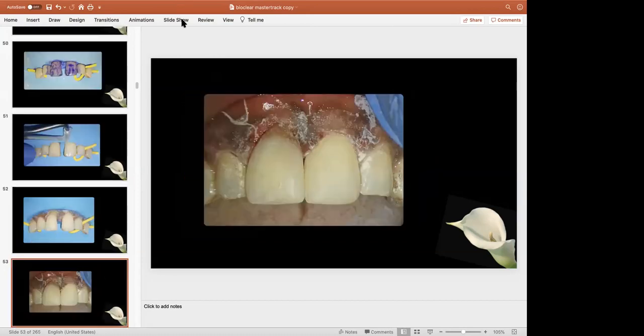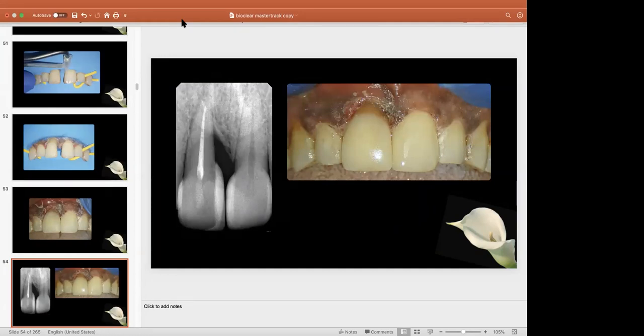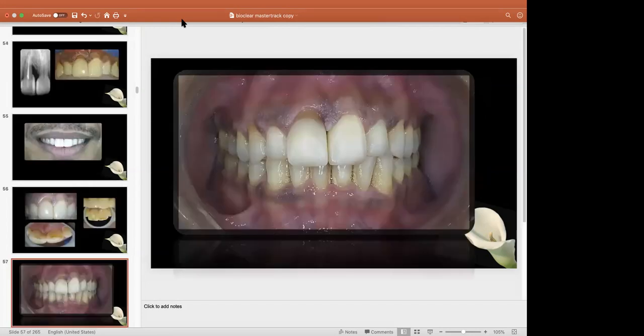And I think my network is again going to go, so I'm going to rush. So I used 101 matrices over here. And the only thing different that I did here was I did inject a bit of pink color gingival composite, just to give it a better look. And that was his smile later. And that was the result after, I think, 1 day or 2 days. So that was the result.